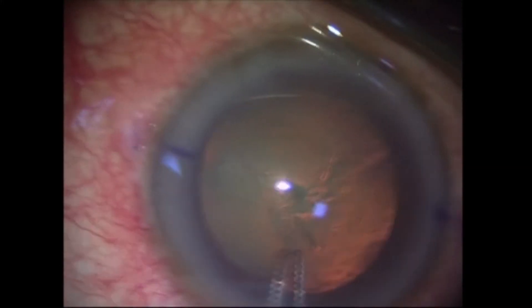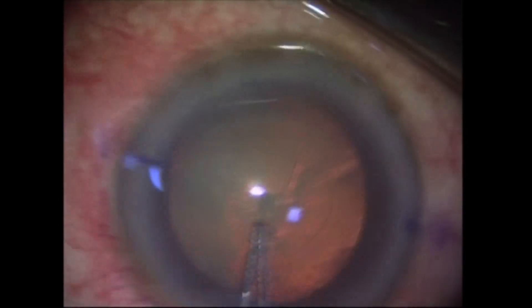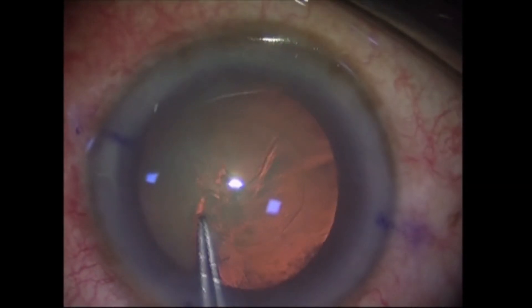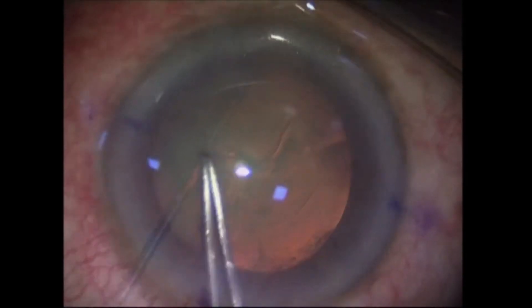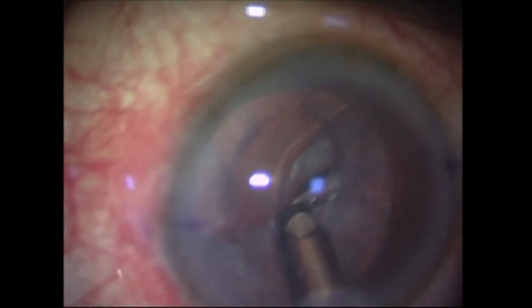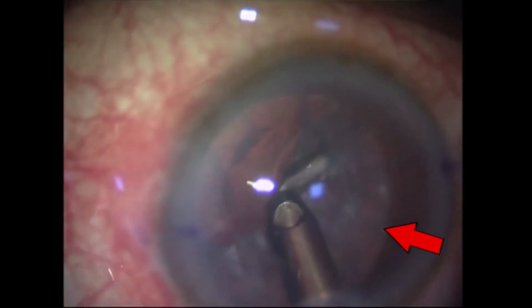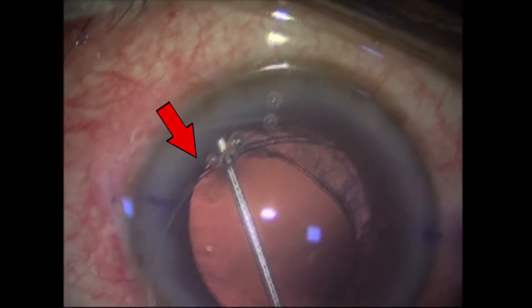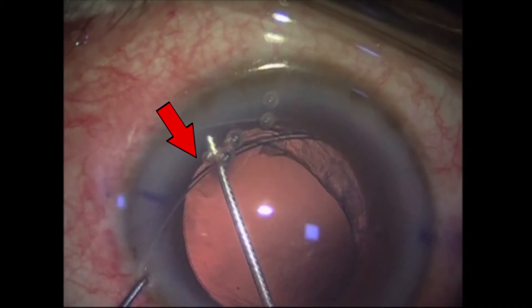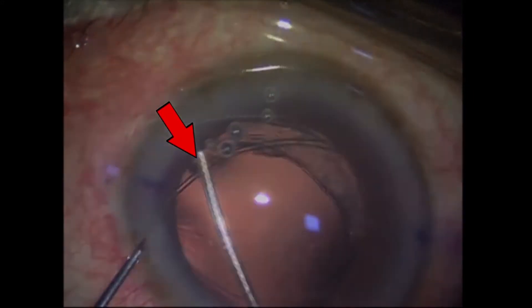A cohesive OVD may be used to prevent rexis runoff. In such cases, one has to take care during cortical aspiration, and such bags may need additional support with an endocapsular ring.